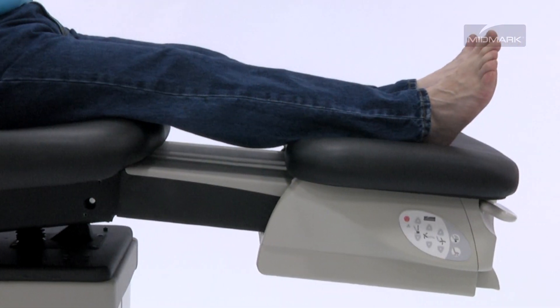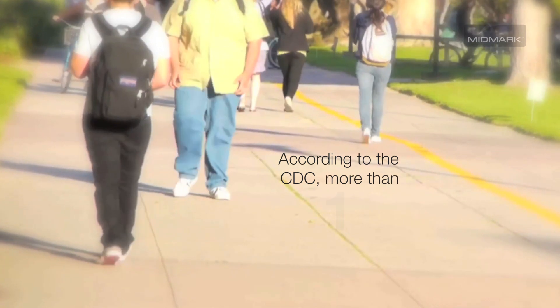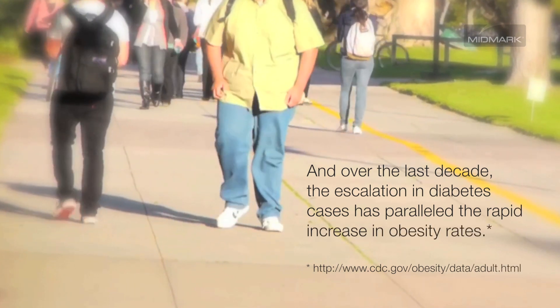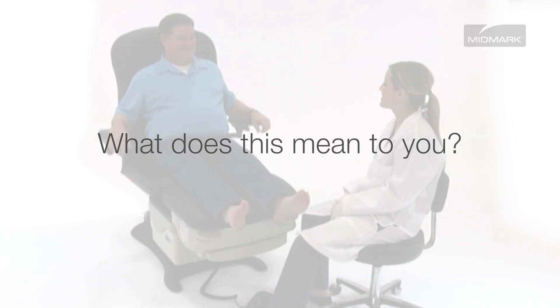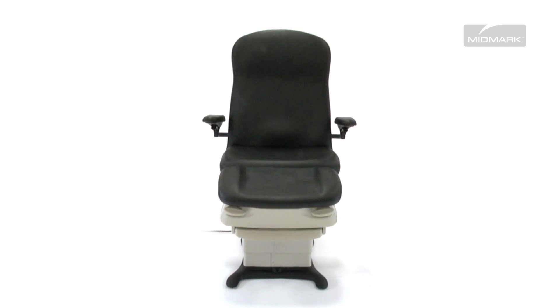The ergonomic foot section is designed to give you the precision control and access you and your patients need. According to the CDC, more than one-third of the adult population in the U.S. is obese. And over the last decade, the escalation in diabetes cases has paralleled the rapid increase in obesity rates. This means more patients requiring more specialized equipment to accommodate their needs. The Midmark 647 is designed with these trends in mind.